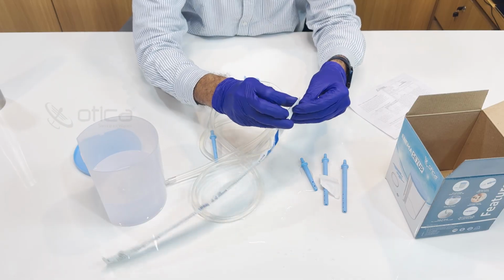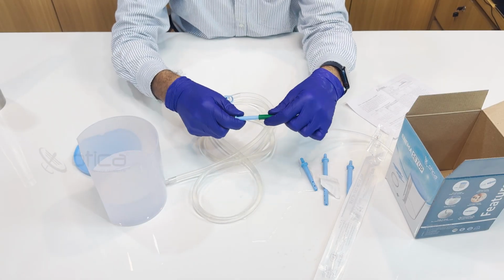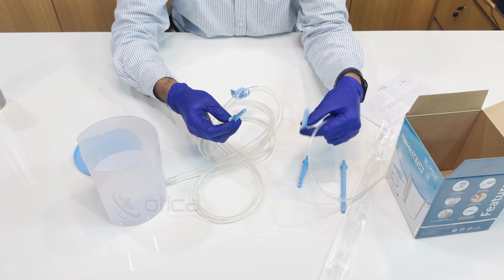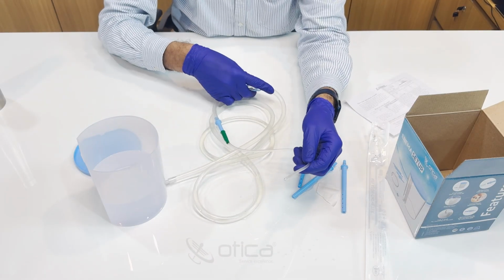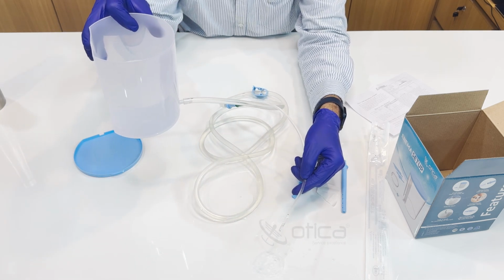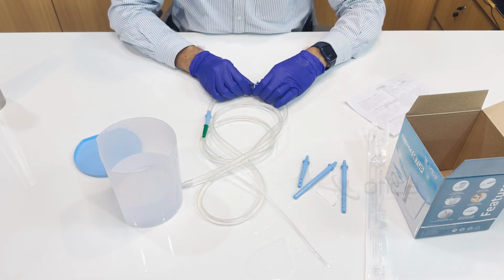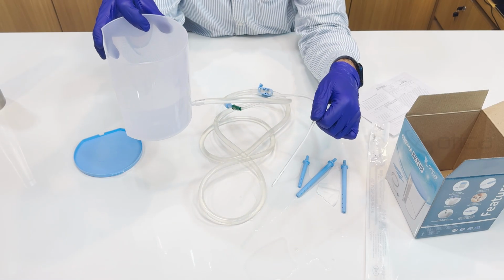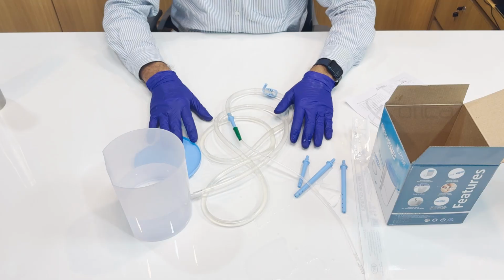You have to open it, and you can just connect this to this smaller tube. Make sure you are connecting it to the small tube, not the large one, otherwise there will be leakage. So you can see now again I am opening the controller and raising the level of the container. You can see the water is coming, and whenever I turn the controller to zero level, you can see there will be no water coming out, or no leakage with this controller. So this is how the Otica enema setup works.